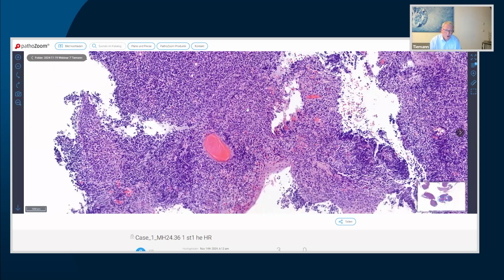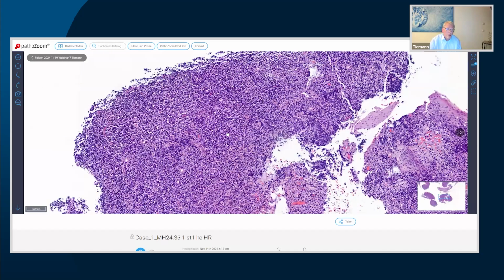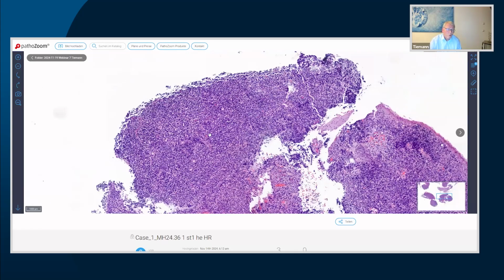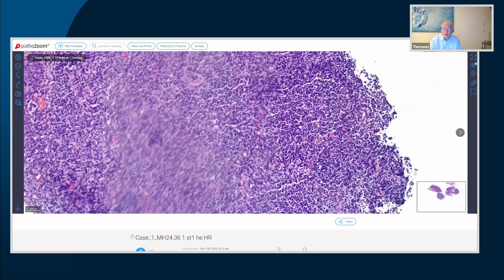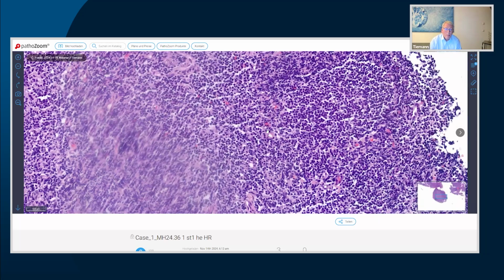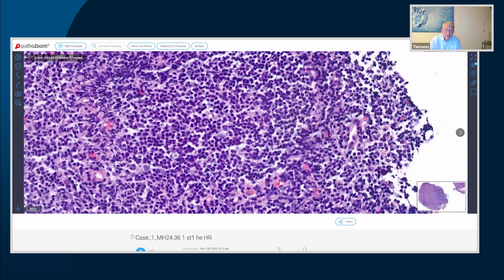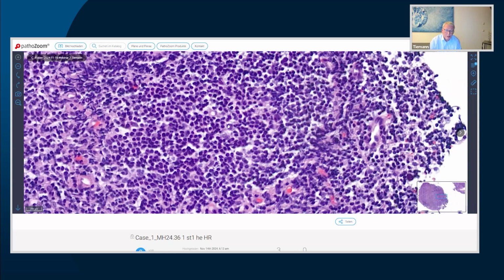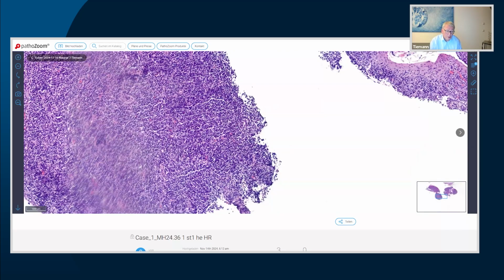Or this is also not normal tonsil tissue, and we should have a short look within other areas, like here. Mostly small cells, some intermingled larger cells, here or here, some smaller blasts. So not very conclusive. What to do? I think at least to do immunohistochemistry.